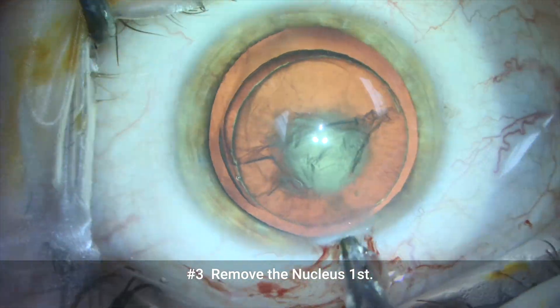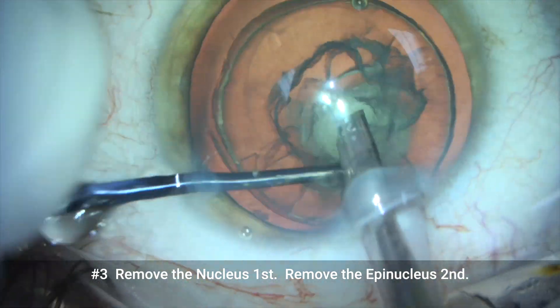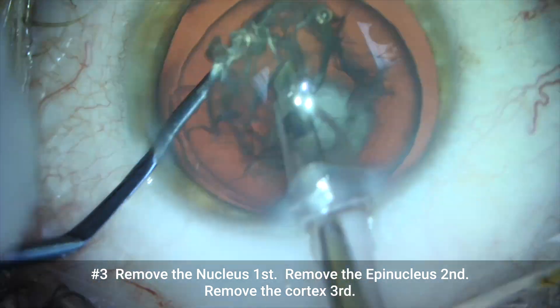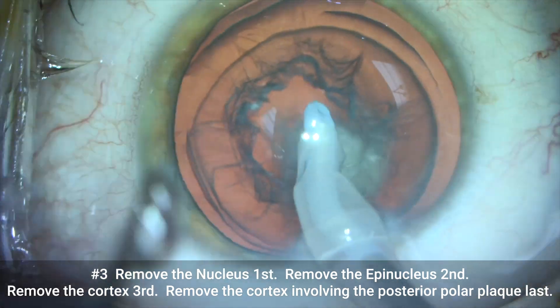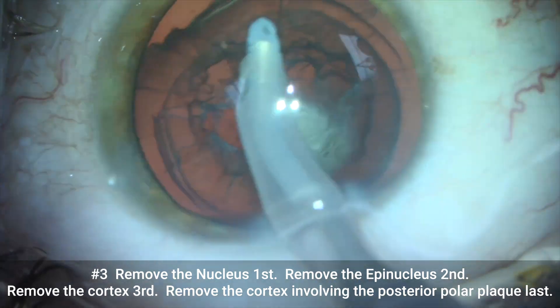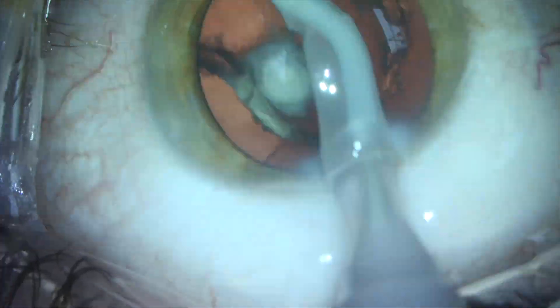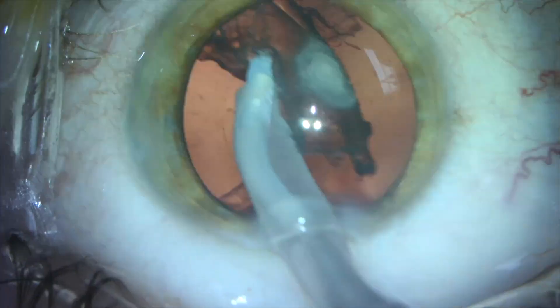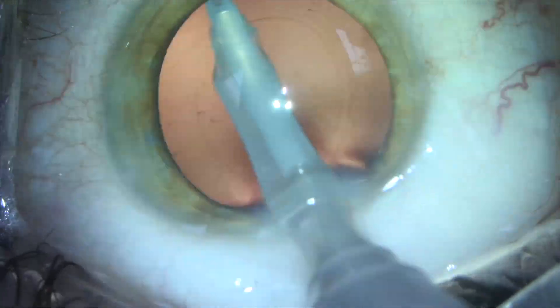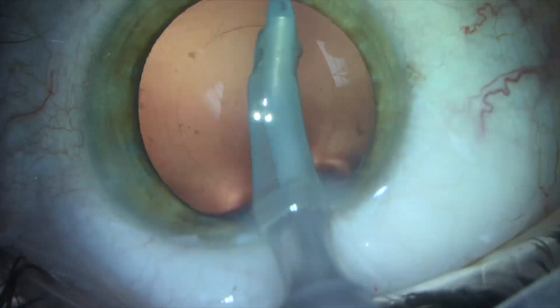Number three, we want to remove the nucleus first, remove the epinucleus second, remove the cortex third, and then finally remove the cortex involving the posterior polar plaque last. We remove these cataracts very gently from the inside out. The most fragile portion of this patient's eye is the area where the posterior polar cataract resides, because usually there is an associated weakness in the posterior capsule just behind the posterior polar cataract itself.